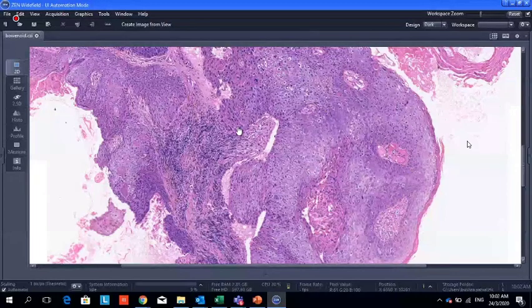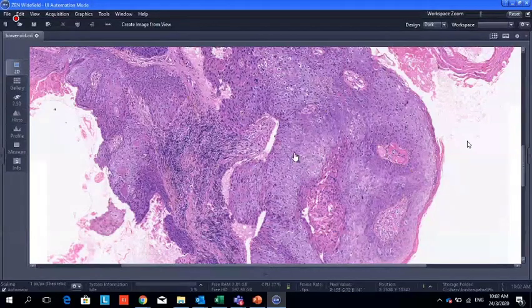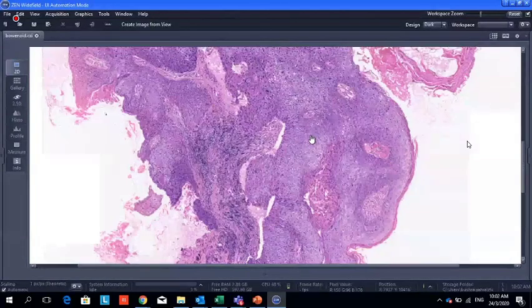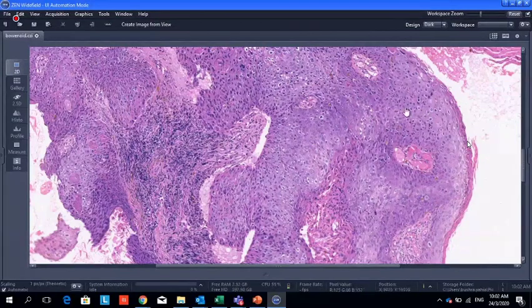Wait, doctor. So these are all neoplastic cells, and they can't be classified as a benign tumor, is it? No, it's not benign, because the cells' behavior is different from benign behavior. They said it may regress. Some Bowenoid papulosis can regress spontaneously, but some do not regress.